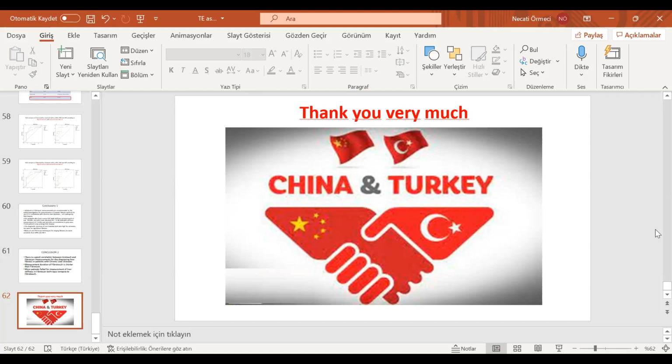Recently, I also read a paper. They also measured the spleen stiffness, and it's helpful to monitor portal hypertension or liver fibrosis. How about you? Can you give us some comment? We haven't done spleen stiffness measurement, because there are too many patients for liver stiffness measurement, so we cannot operate on so many patients.